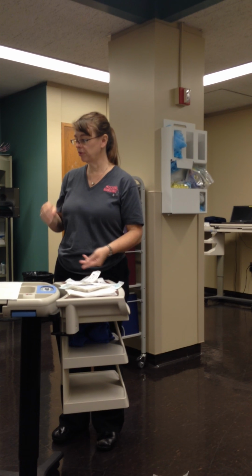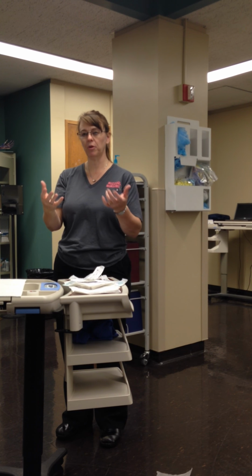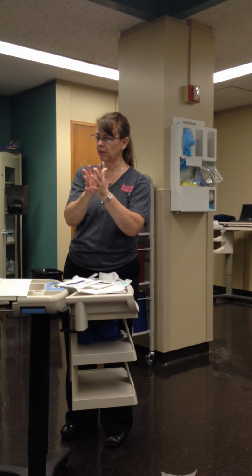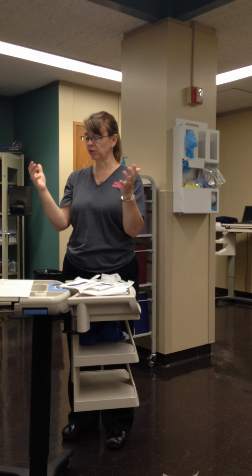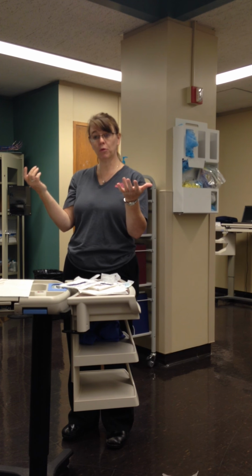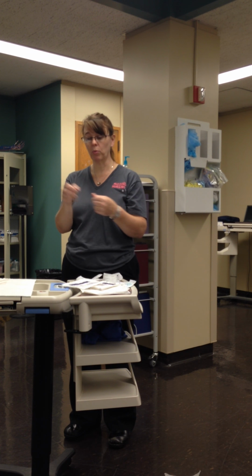So sometimes we'll have a student get everything set up and they forgot that they didn't put a gauze out and they put on their sterile gloves and then they do this. You cannot do that. That's breaking your sterile. Now, we'll say Allie did that. She got her sterile gloves and then she looked at me and she went, I forgot to put my gauze out there. Then I'm going to say, well, what would you do in the real world? And Allie would say, I'd ask somebody to open one for me. So we can open one.